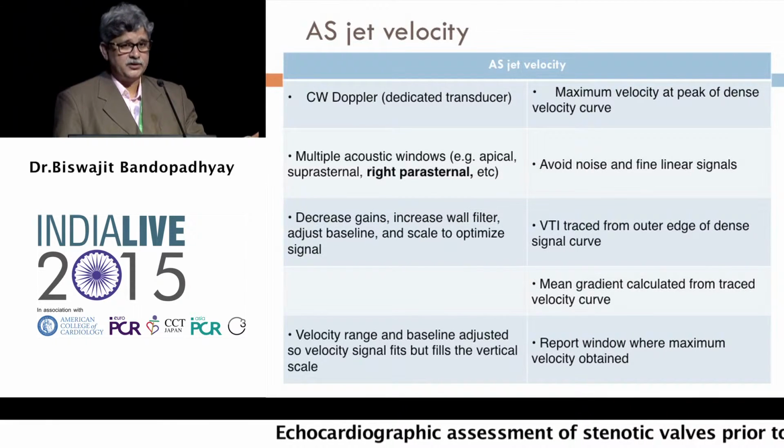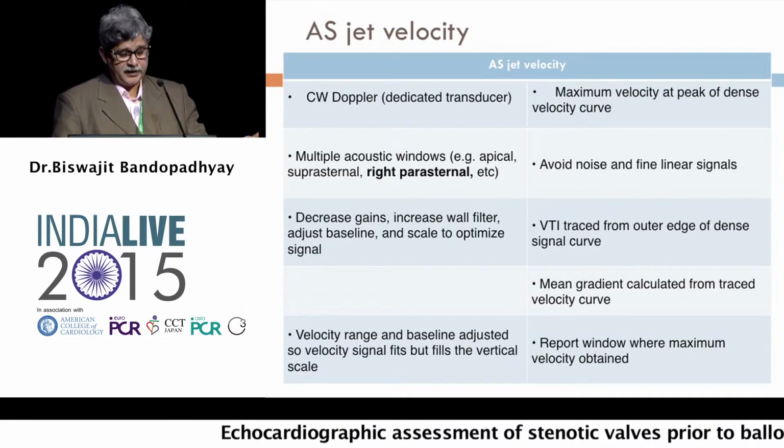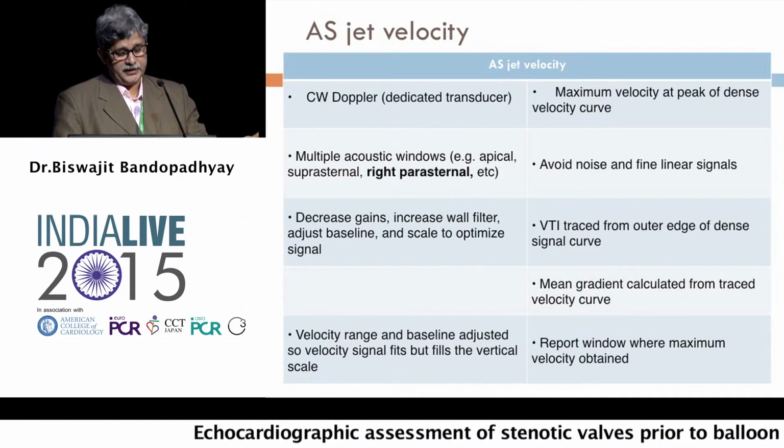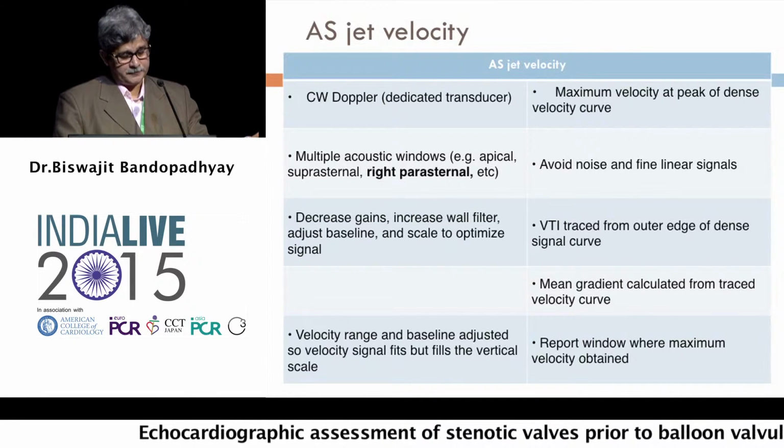The right parasternal view: turn the patient slightly onto the right side, and then take the gradient. It gives you a perfect alignment with the cursor.